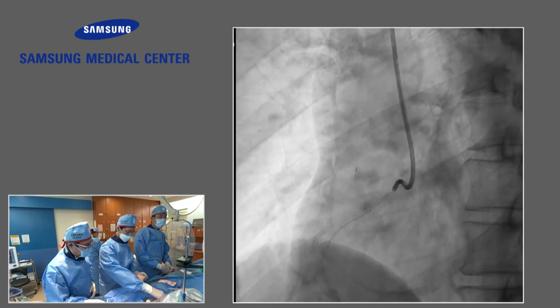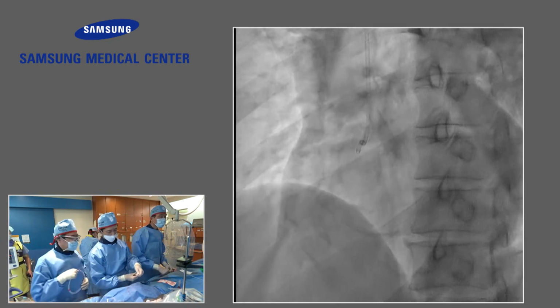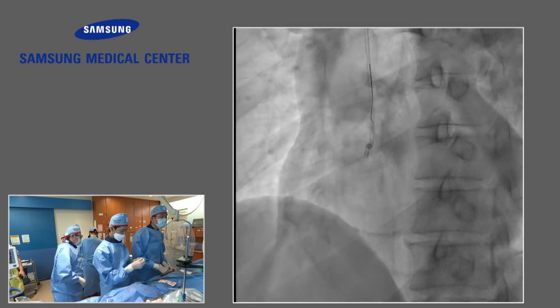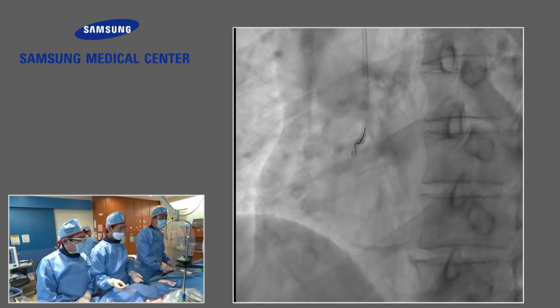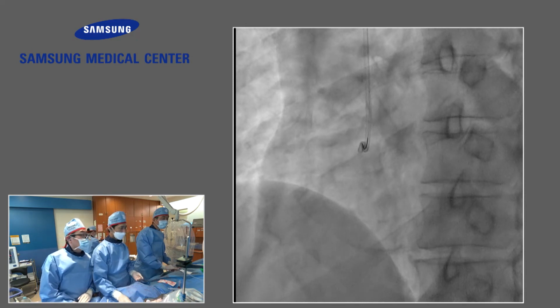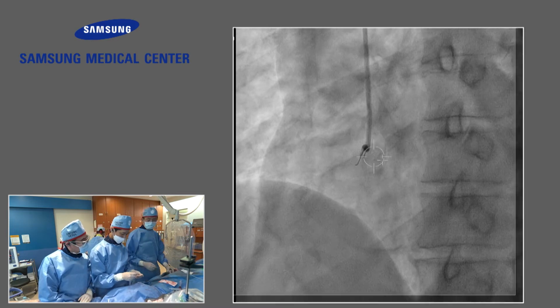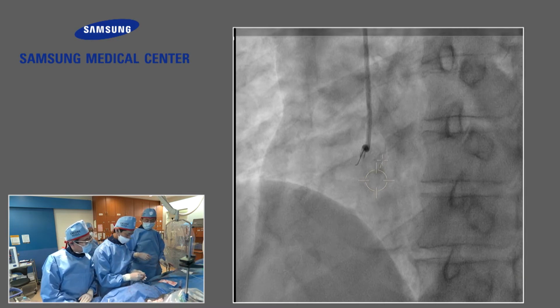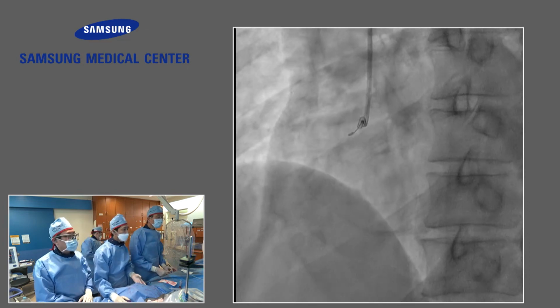It is a very interesting case. The proximal stump anatomy is not favorable because of two fine side branches, but there is no calcification. He noticed it and just tried to probe the wire, and luckily the UB3 wire entered the CTO segment.